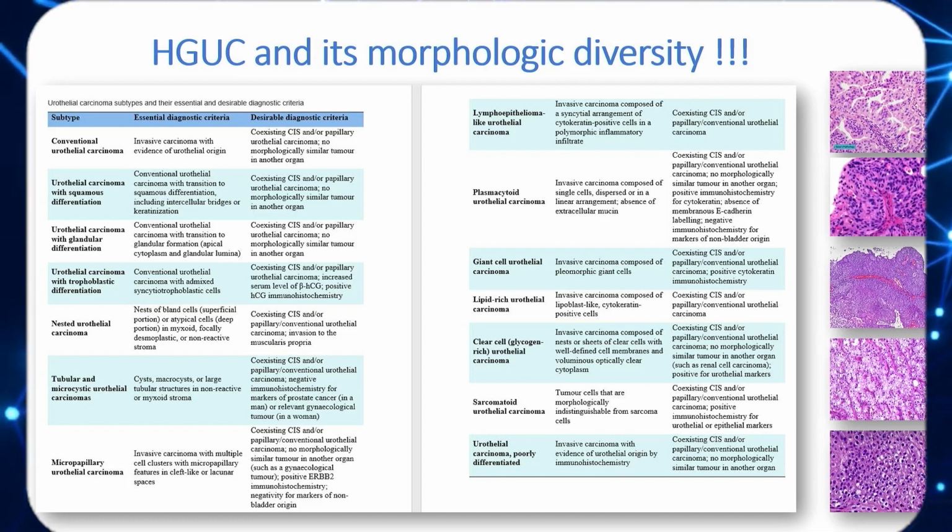So these are outlier situations, and again, what I want to focus on is the conventional urothelial carcinoma as what we have to address. You need to be aware of the subtypes, and if needed, use the Paris system judiciously, but you can still work outside its listed given criteria if you're familiar with the various subtypes.